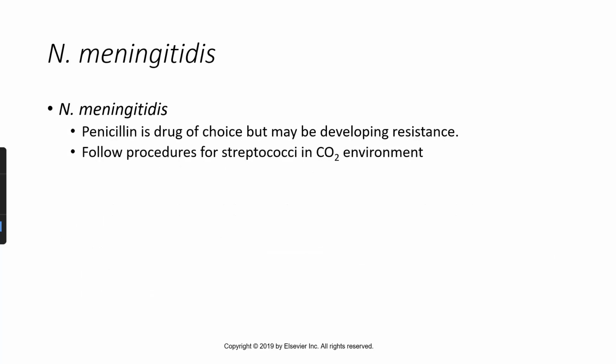And meningitis causes, it's Neisseria meningitidis, which just causes meningitis, a very severe form of bacterial meningitis. Penicillin is the drug of choice, but may be developing resistance. You follow the procedures for streptococci in a carbon dioxide environment.